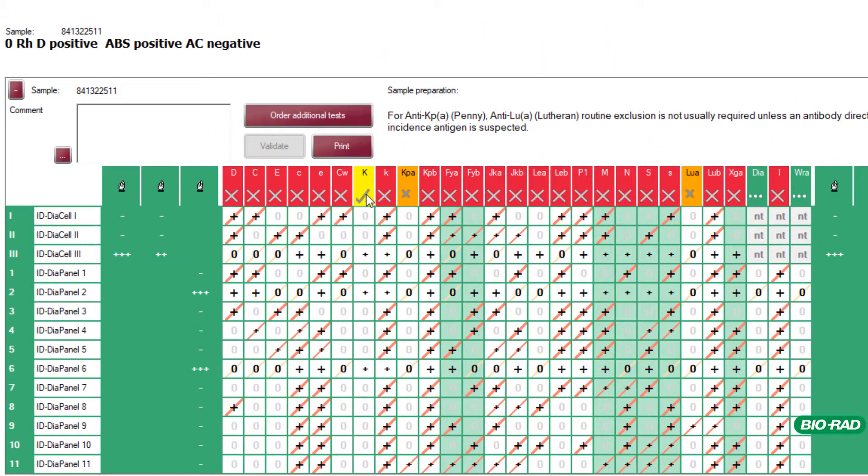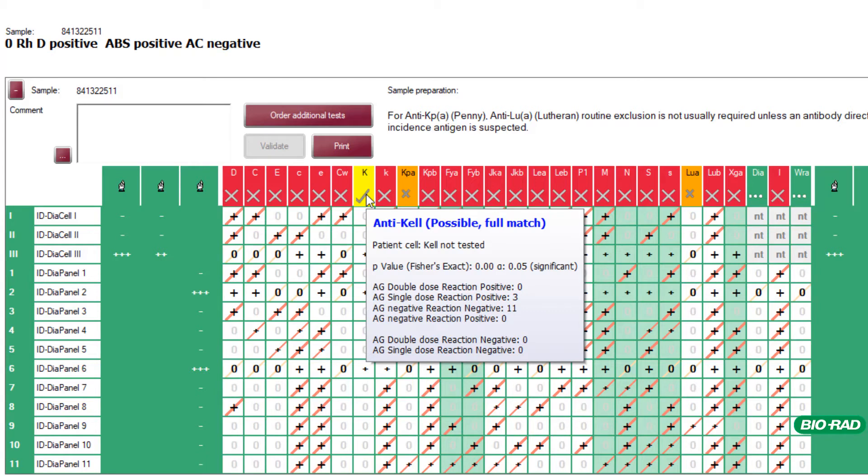Hovering over the Antibody will give the user a breakdown of the number of positive and negative reactions. Also included is statistical information and if any phenotyping data is available for that patient.